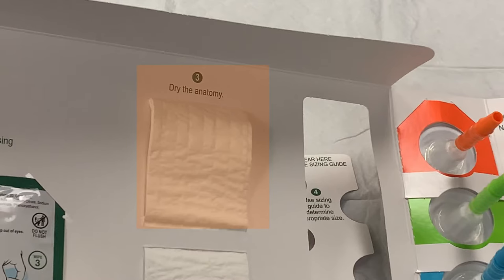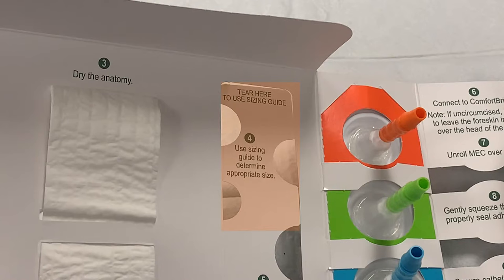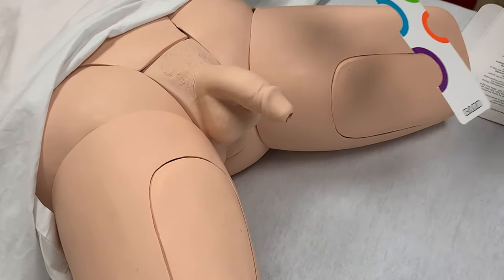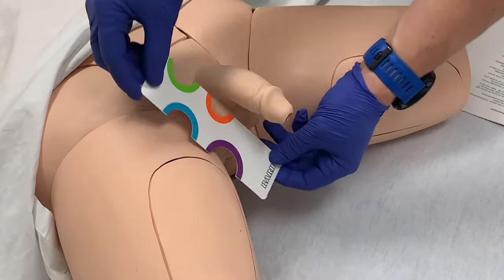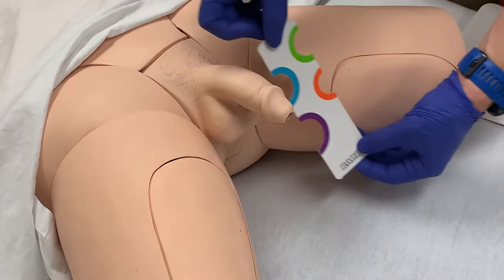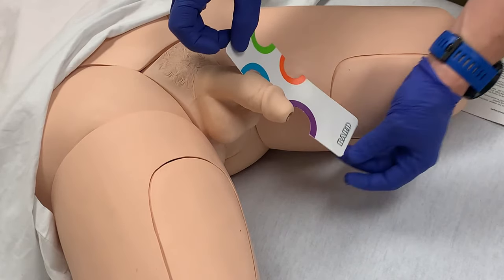Step three is to dry the anatomy. Use the provided towel to dry the patient before placing the catheter. Step four is to determine the appropriate size of catheter. The kit has a sizing guide included. Remove the rectangular guide from the package and use the color-coded sections to find the best fit for the patient. The openings of the sizing guide are color-coded to match the packaging of the different sizes of catheter. This patient fits a blue catheter.